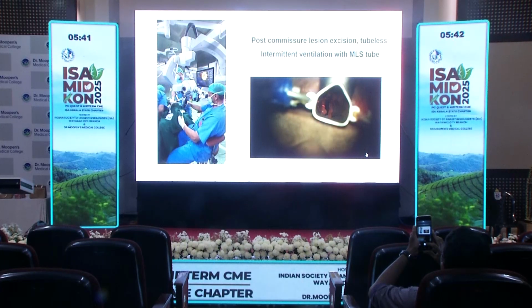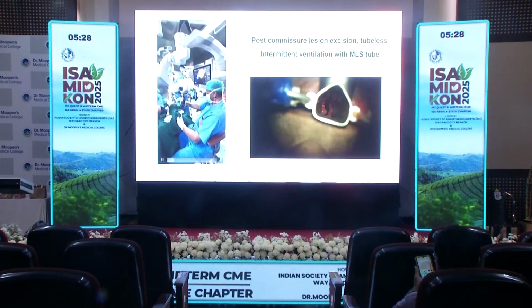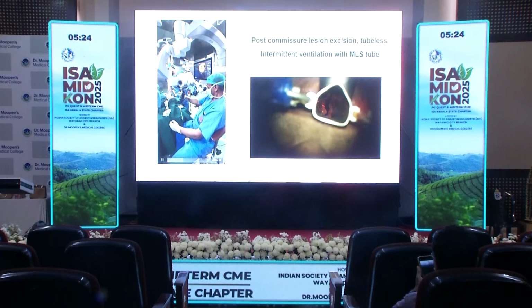In this, it's a patient with a posterior commissure lesion excision. Here, the surgeon demanded a tubeless technique. So, it's just the procedure being done, and behind the screen, you can see the resection being done.